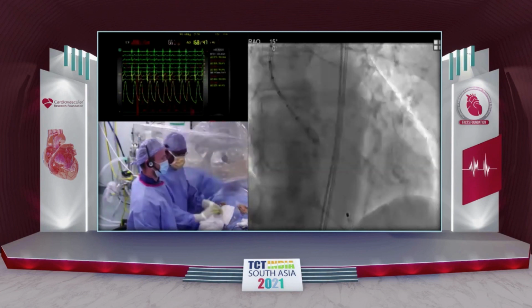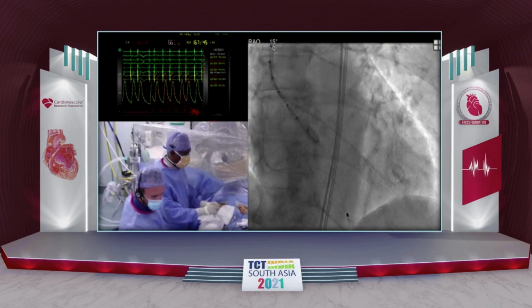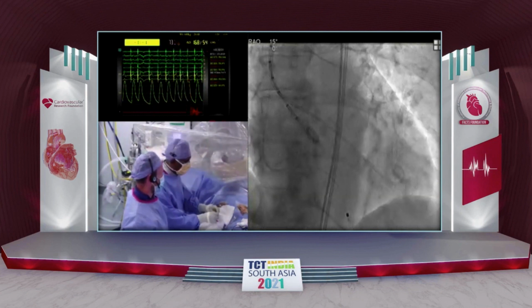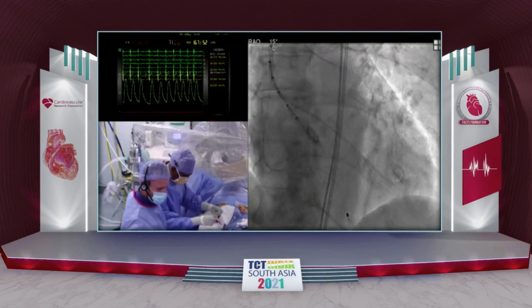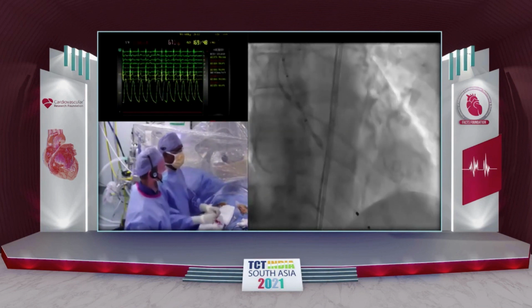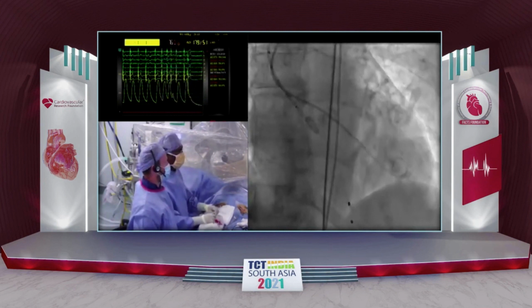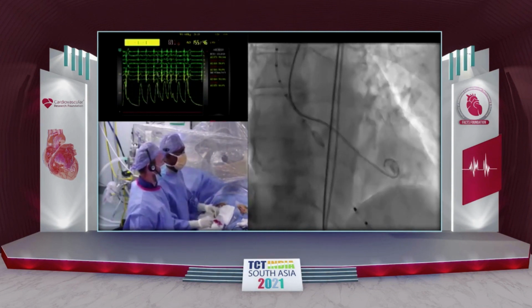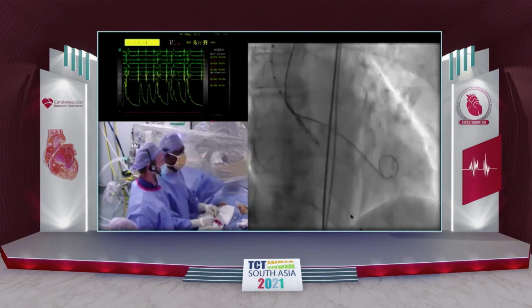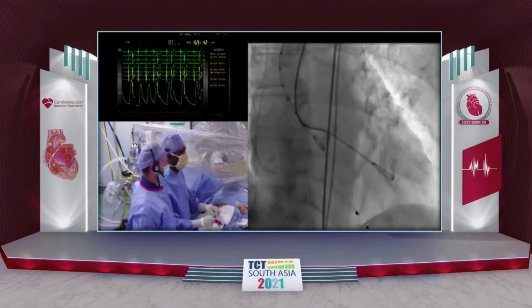Ganesh, would your wire selection be decided by the aortic angle? Would you like to use a stronger wire? A good point. From the deployment technique we're going to use today, we will not use the wire at all for any positioning of the valve. This patient also has quite a hypertrophic and very small left ventricle. You're alluding to using a Lundquist wire or something like that, right? Yeah, or a double Lundquist.